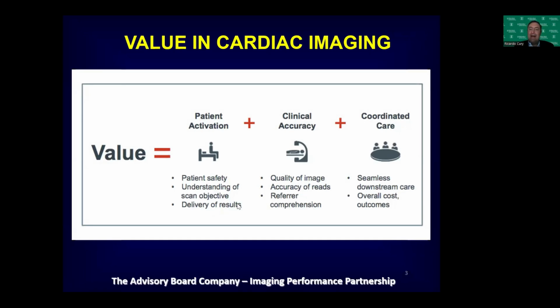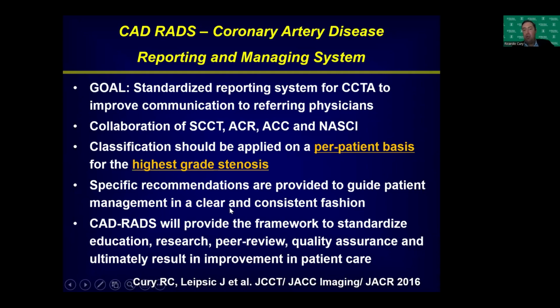And really, with the PROMISE trial, we realized that it's not only about reporting the coronary CTA. We need to have this communication, have this dialogue, and guide the next steps in patient care in order for CTA to achieve its maximum capacity. So back in 2016, we had the first version of CAD-RADS, with a goal of standardizing coronary CTA reports to improve communication to referring physicians. It was a collaboration of the Society of Cardiovascular CT, ACR, ACC, and NASCI.